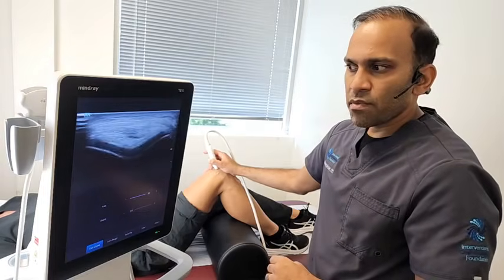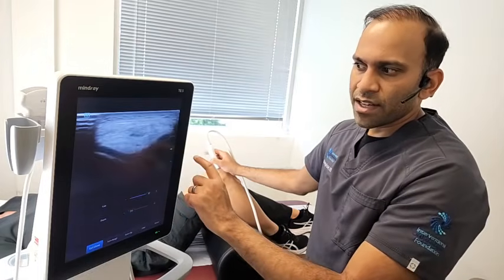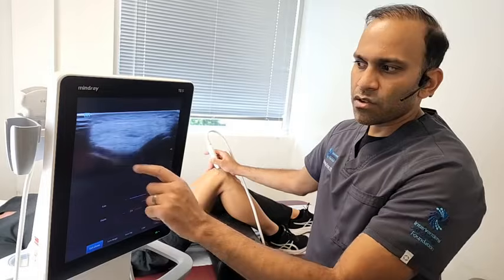So as I move my probe a little bit, you're going to see the kneecap come into view here, and you can see that that's sitting nicely in this groove.